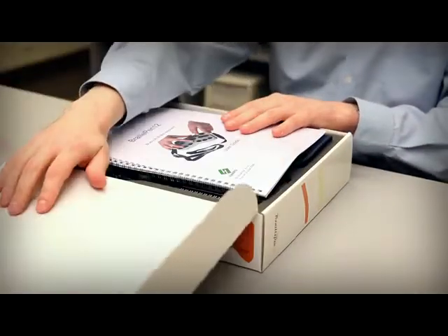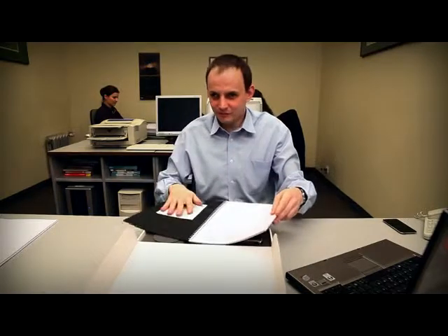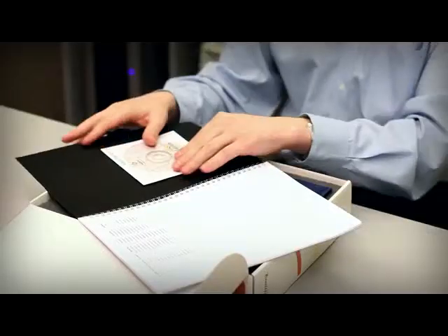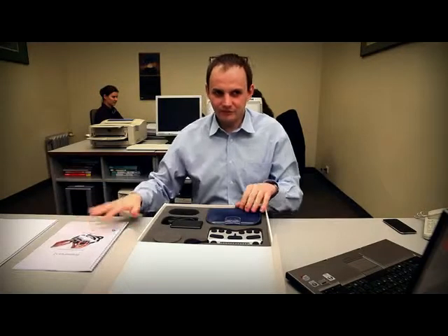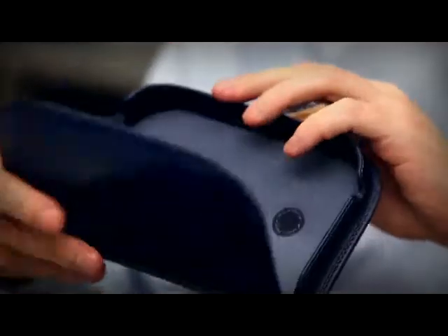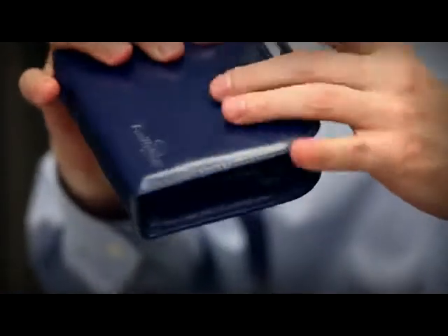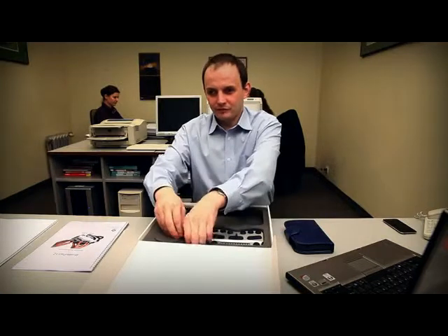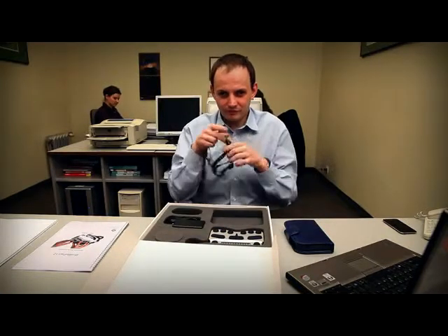The first thing we find when we open the box is the printed user guide. Once we set that aside, there are many goodies. First is the CD with the user guide and some software on it. Then we have a pouch for the Braille Pen 12. And then the lanyard, which gets attached to the Braille Pen 12.